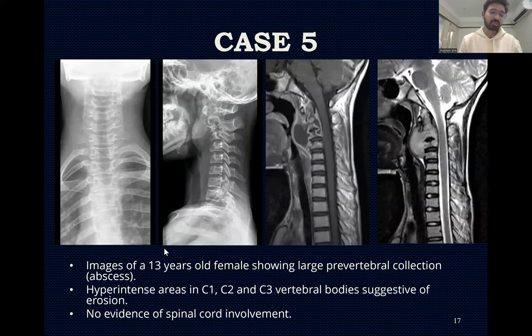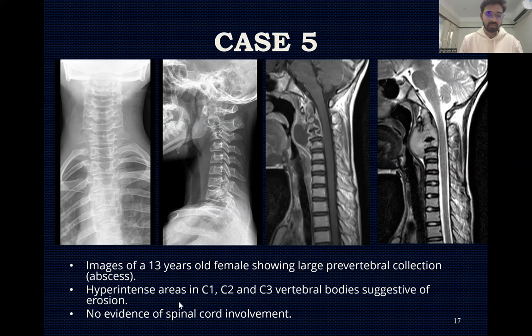Case five: Images of a 13-year-old female showing a large pre-vertebral collection, likely an abscess. Hyperintense areas are seen on STIR sequence at the C3 vertebral body with signal changes. No involvement of the spinal cord was noted, with sparing of the spinal cord demonstrated.